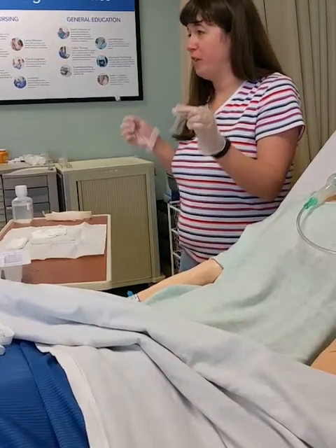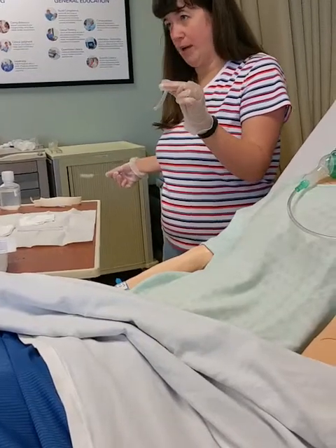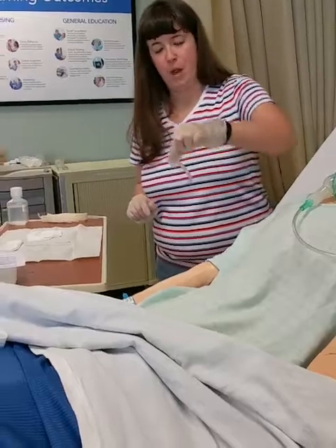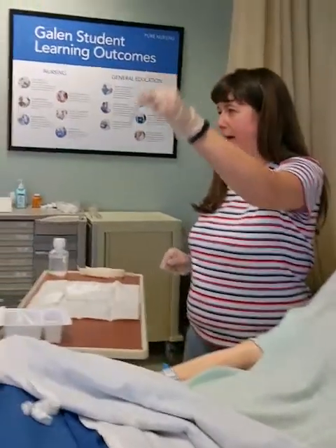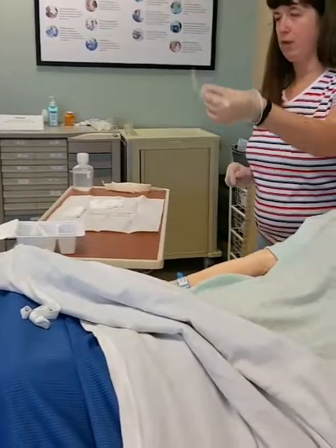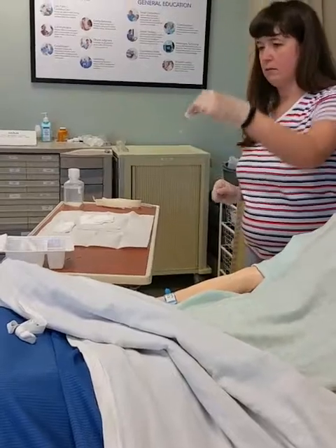In practice, when you're done with the brush, put it on your table because you're going to repack these kits to practice with. But in real life, just pitch it. Because we don't put hydrogen peroxide back into the patient's body, we're going to go into the saline, rinse, rinse, rinse, rinse, rinse. You may want to rinse it 2 or 3 times.